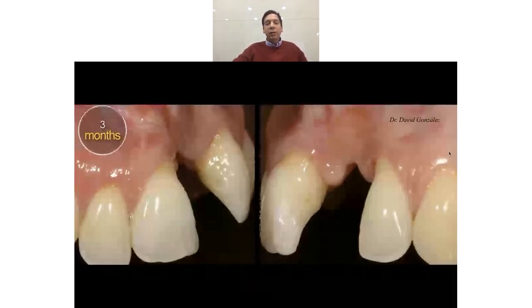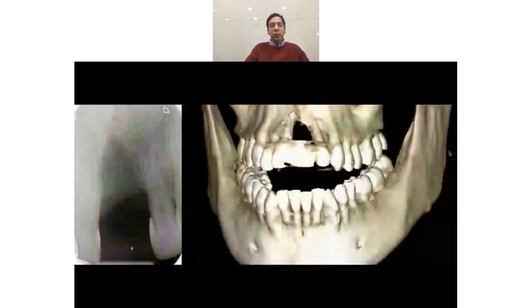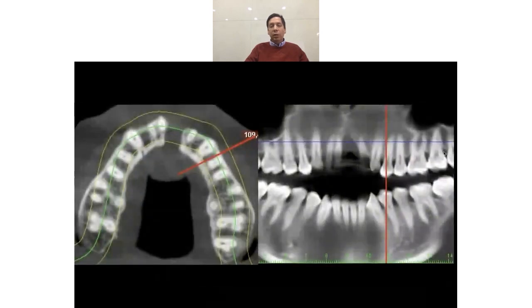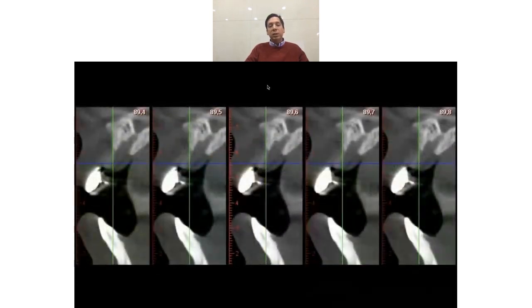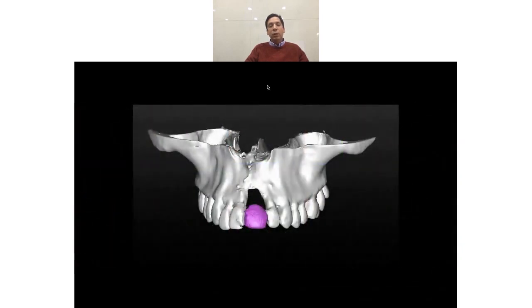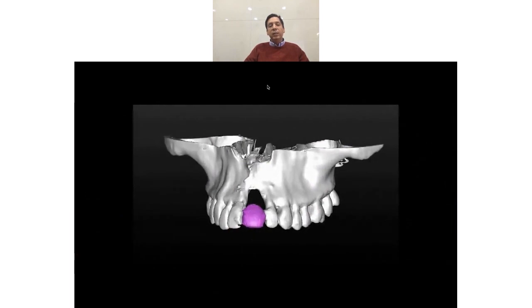We can see here that we have a big deficit of soft tissue. We see the recession, and this is the CBCT and the periapical X-ray. On this blue line here, we see that we have no bone at all in the palatal aspect. This is the lateral view. And now we will see the CBCT.